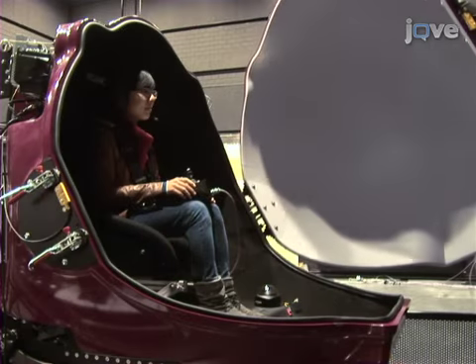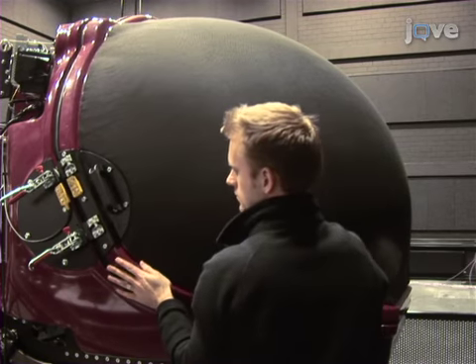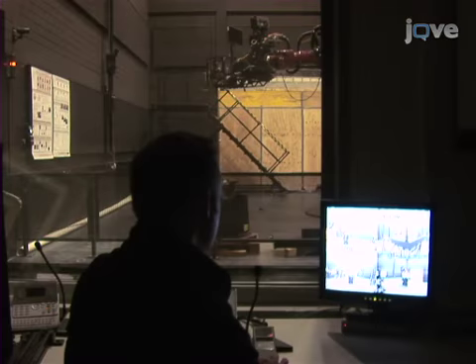Continuous noise is played through the headphones, which masks the noise of the robot. Experiments are also possible by seating participants within an enclosed cabin. As the experiment is performed in darkness, infrared cameras allow visual monitoring from the control room.